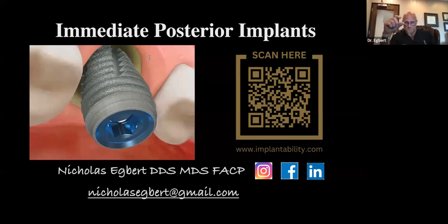If you have less than 50% of the facial plate left, I highly discourage you from attempting that. It is possible in a super healthy patient with thick tissue, excellent compliance, and a hell of a lot of luck. You might get away with that, but otherwise, I would limit that to having 50% or more of the facial plate. But you have a few different options.